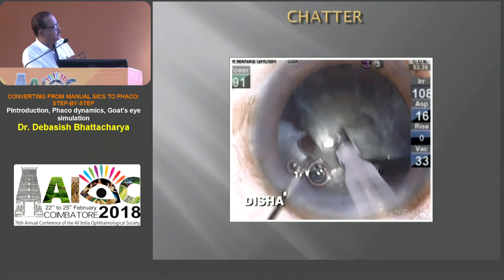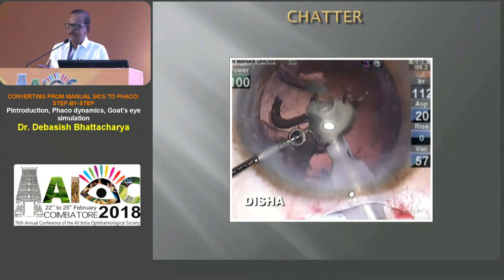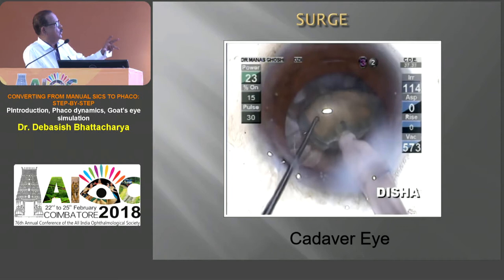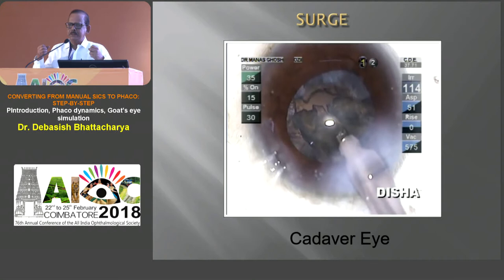This next example shows chatter when you are using less vacuum and more power — you can see how the fragments chatter. There has to be a balance. You cannot use less energy for a harder cataract, and if you are using more energy it has to be balanced. See here: if you use more power, vacuum, and flow — this is a cadaveric eye — you get a posterior capsule rupture. The moment the occlusion is broken at very high vacuum and high aspiration flow, the tubing suddenly draws in a lot of fluid, and that's how we get a PCR.